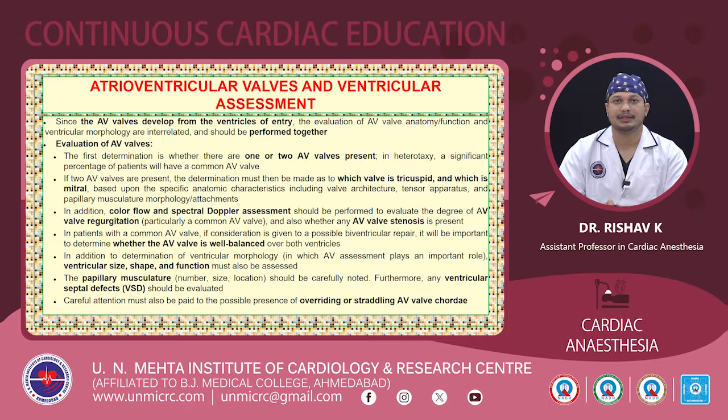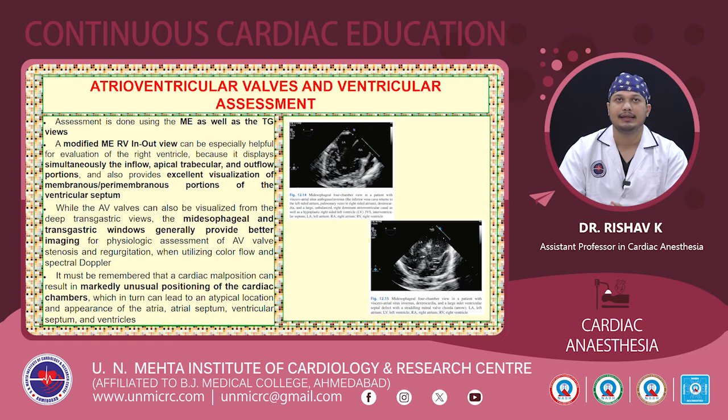In addition to determination of the ventricular morphology, we have to determine the ventricular size, shape and function. Papillary muscles should be carefully noted, and any presence of ventricular septal defect should be evaluated. Also, whether there is any overriding or straddling AV valve chordae, that is also one thing that should be seen. So, assessment of these structures is done by using the midesophageal as well as the transgastric views.